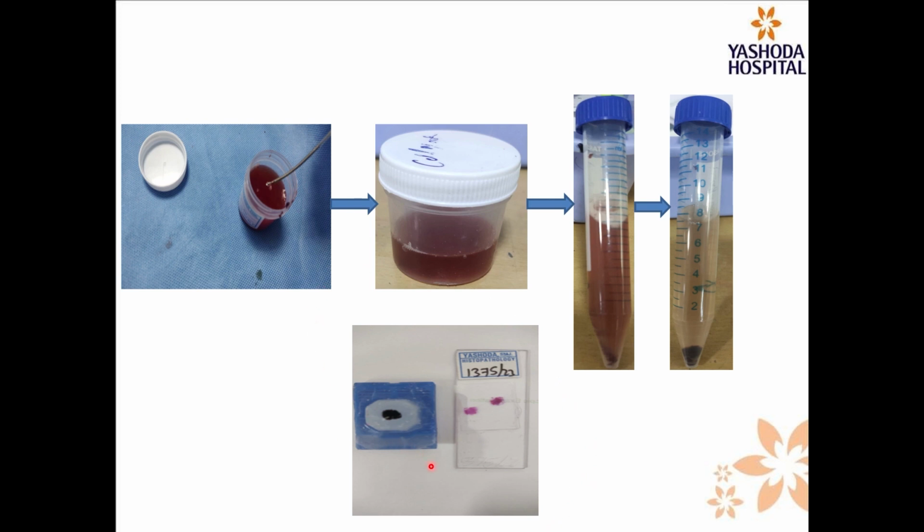So I would not say it's a very less tissue, but of course, the large quantity of material that is procured is transported to us, and then what we get is this tiny 0.8 centimeter tissue, and then we have to actually triage this tissue, and it's extremely important for us to know what all we can do with it.